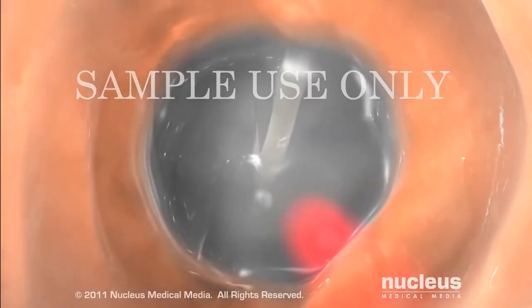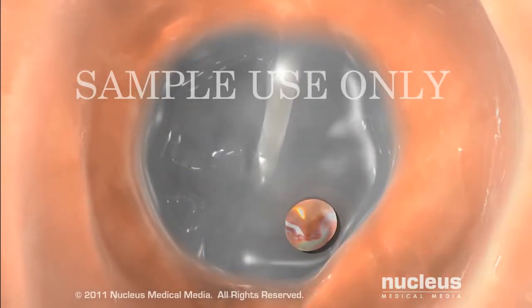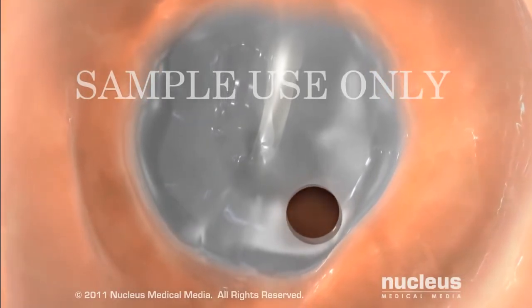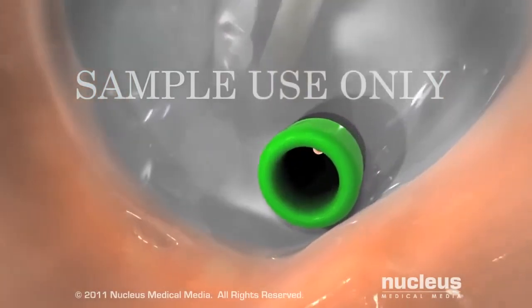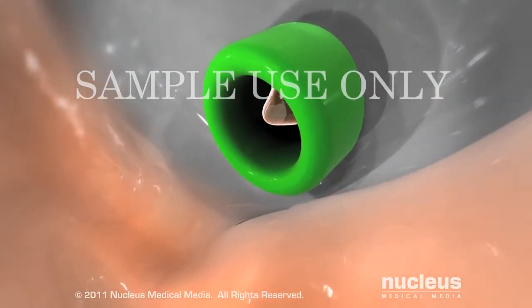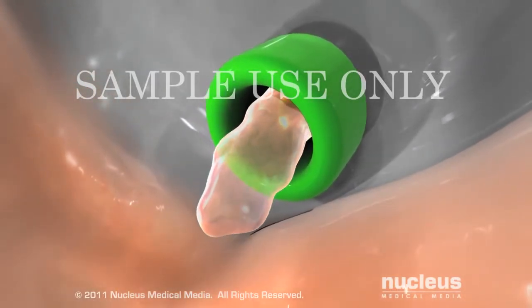The surgeon will make a small incision in the eardrum using a scalpel or laser and drain the fluid in the middle ear. In many cases, the surgeon will place a ventilation tube or PE tube through the incision. This small tube will drain any fluid that collects after surgery and allow air into the middle ear to help dry it out.